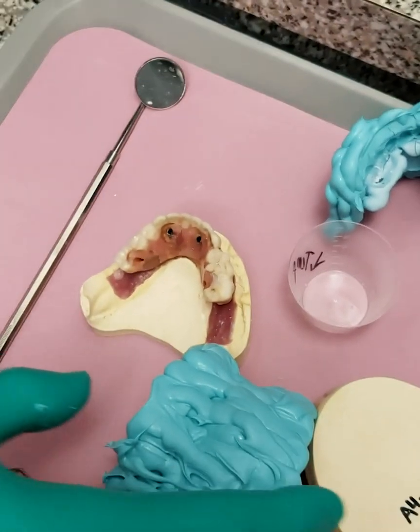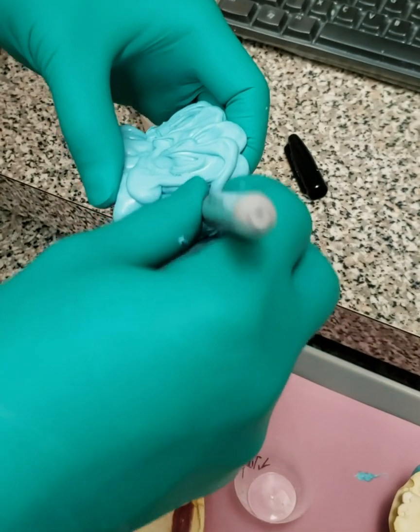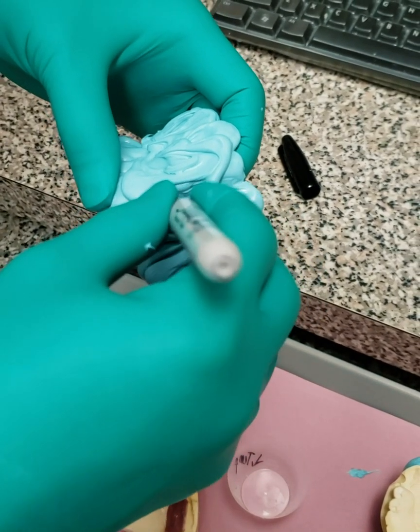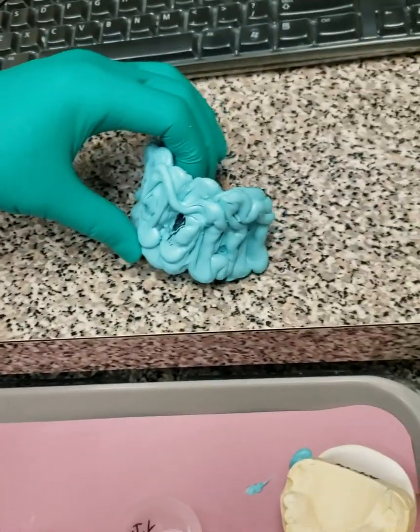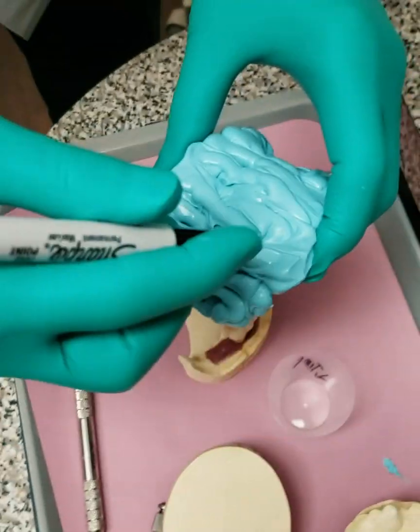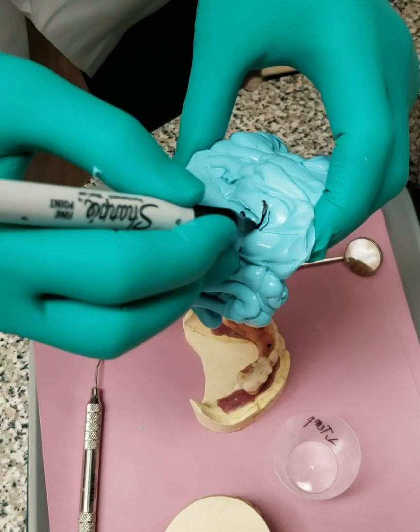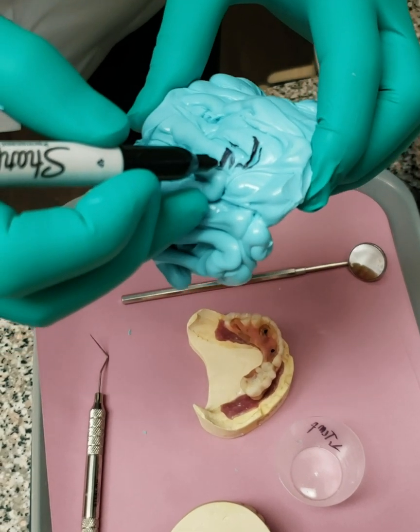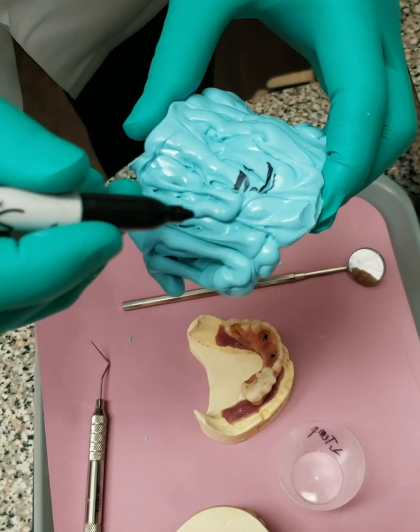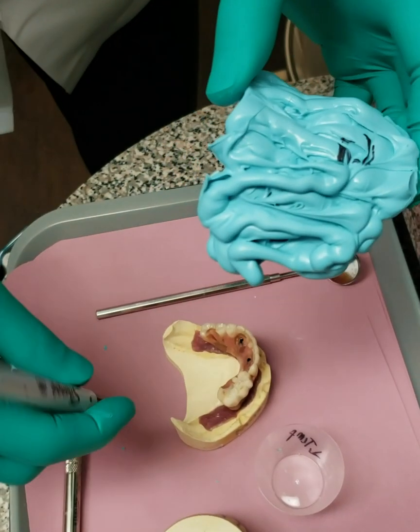Now, what you need to do is take a marker and mark number 1 so the laboratory will know that they mount, in this case, the lower working model to the upper study model, and you'll put number 2 so the lab will know that they'll mount this after they've mounted the lower verified model to the upper study model. Then they'll mount the upper verified model to the lower verified model.